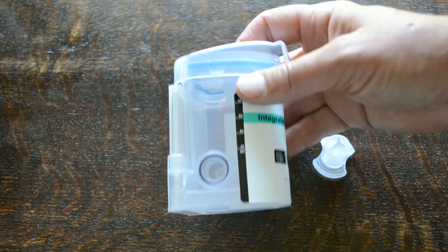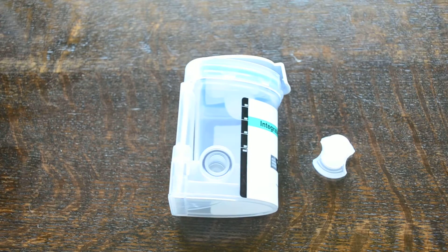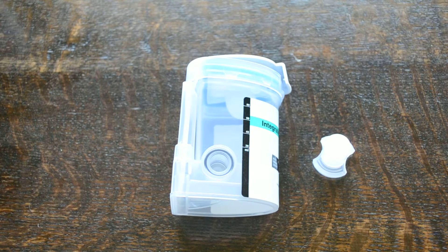Other test cups with a similar design don't have this collection and test chamber system. That's what gives the EZ integrated cup from Instalert the edge when it comes to design, when selecting cup drug tests — particularly when tests are being done in employment, workplace, or healthcare environments where confirmation testing is a significant element of your screening process.